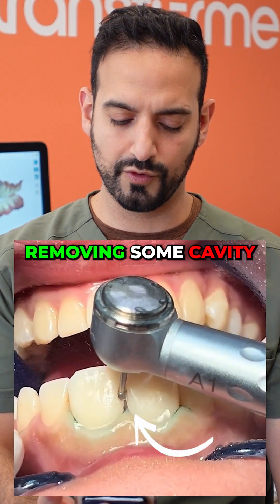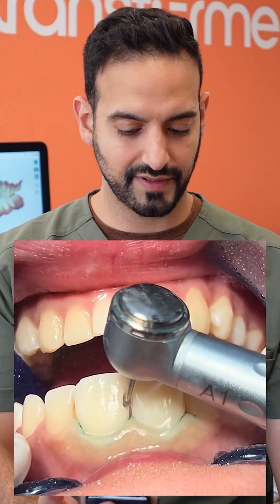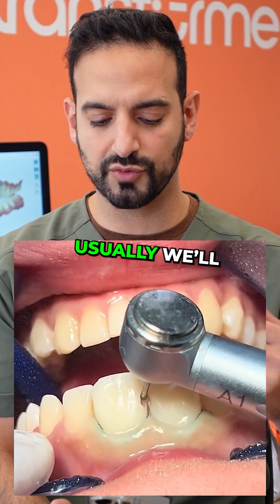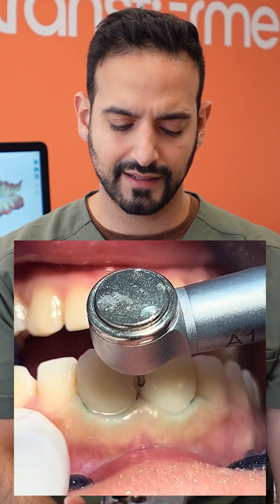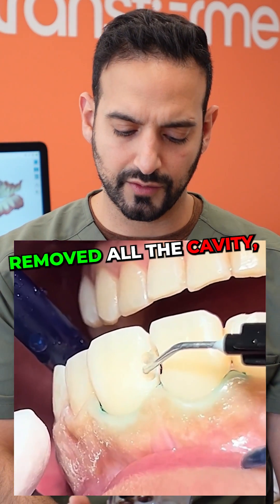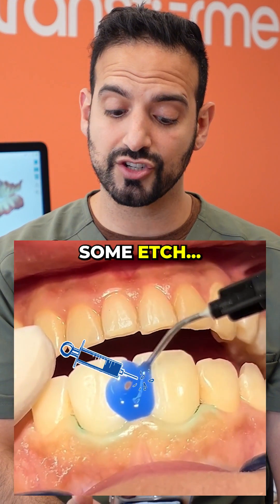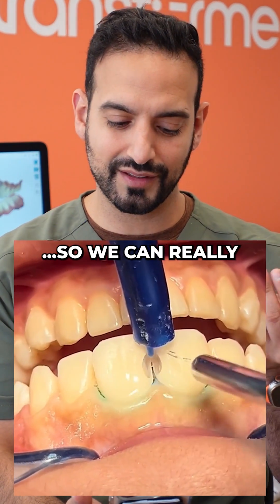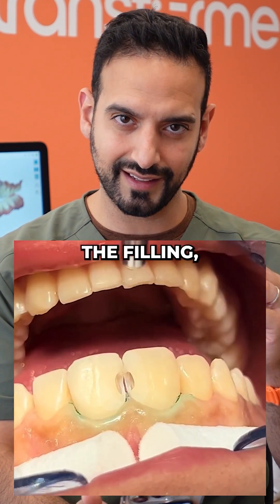Moving some cavity here in this video — opening up the tooth. A little surprised that we're going from the front; usually we go from the other side so you keep the front intact. Maybe some of it was showing from the front, so they removed all the cavity. Now putting some etch — that's an acid we put on the tooth to open up the pores so the bonding and filling can really stick well.